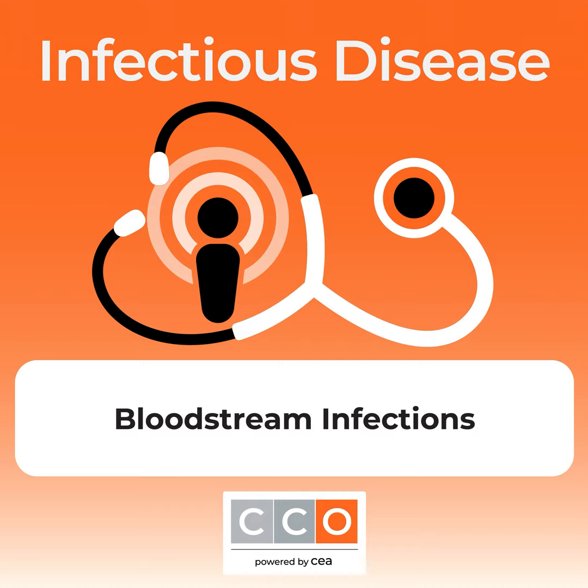We additionally want to observe that blood culturing practice to identify barriers to improvement. Again, making sure all of our staff responsible for blood cultures are using appropriate aseptic technique, and that we're providing education on how to obtain those good cultures we talked about in terms of the optimal number of bottles of blood cultures, optimal filling volume, and contamination reduction strategies.